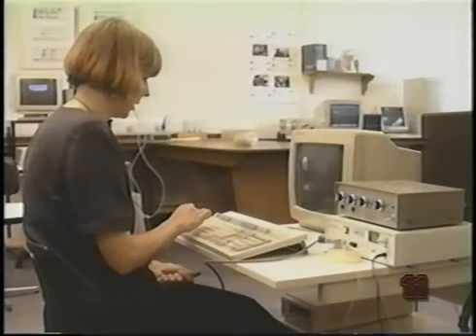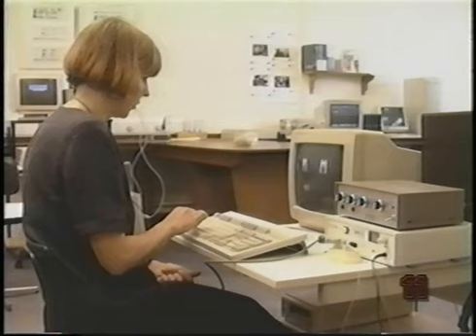Lateral approximants also show distinctive patterns of contact which depend greatly on the vowel environment. Compare, for example, Allah. Allah. and Ali. Ali. The dynamics of tongue activity in more exotic sounds can be studied with EPG.